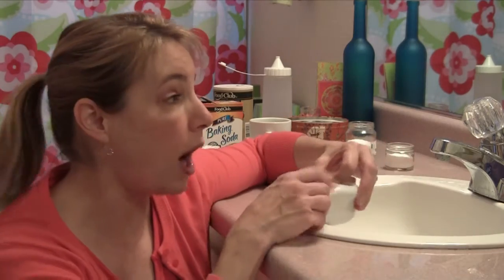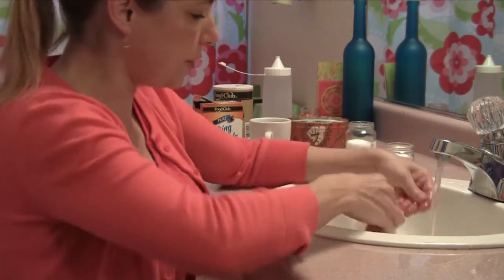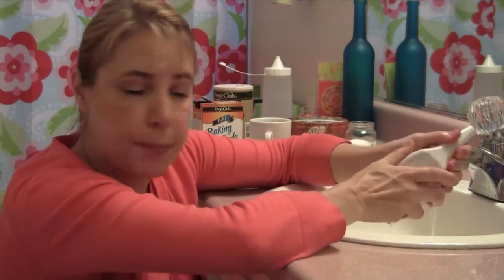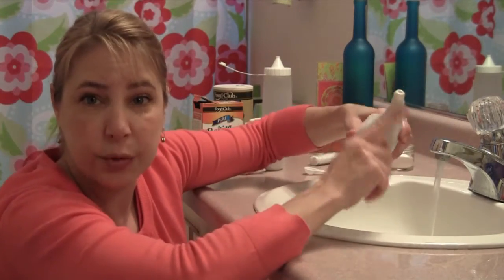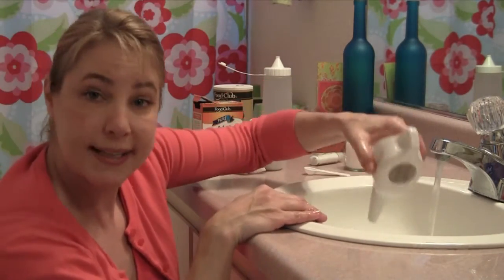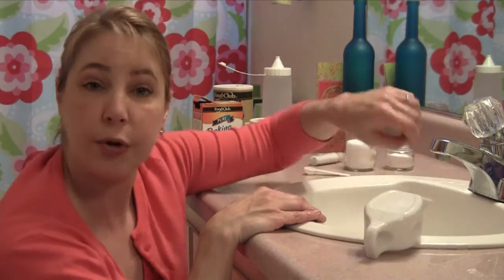When you're done, you want to wash off your neti pot. So I'm just going to use my antibacterial hand soap here, and I'm just going to wash it right here like this. You can also use a handy wipe, that works too, but I want to do the part I touched with my hands in case they had any germs on them, and I always want to do the end where it touched my nose. And then I just rinse it off, and then you just tip it upside down on a paper towel, and it's good to go. It's waiting for you next time.